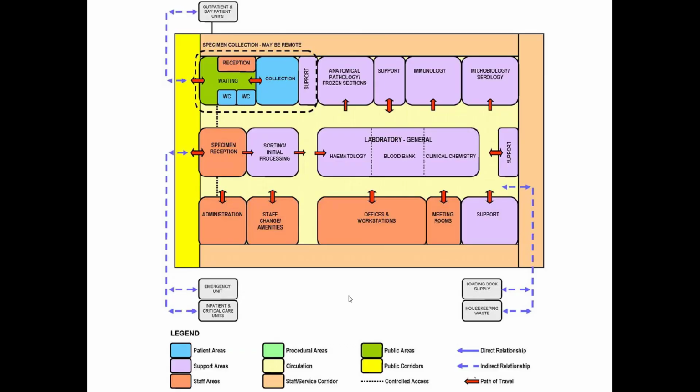This functional block diagram shows different spaces and the circulation inside a clinical laboratory.